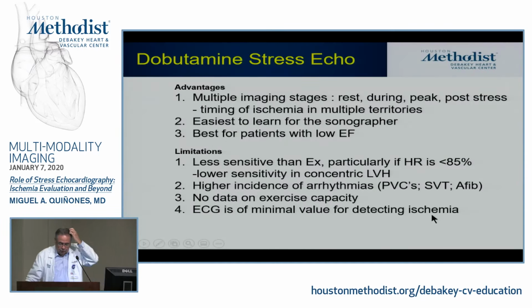All right, so dobutamine has the advantage that you can do multiple imaging stages, just like a bike, easy on a sonographer, okay? And it's also very good for low EF. In fact, dobutamine is the preferred test for a low EF. So if you have a patient with low EF, now you're looking at viability issues. And you want to go gentle with dobutamine because you want to see that segments improve and worsen. And dobutamine gives you a more gentle way of doing that than a bike, and forget about a treadmill.